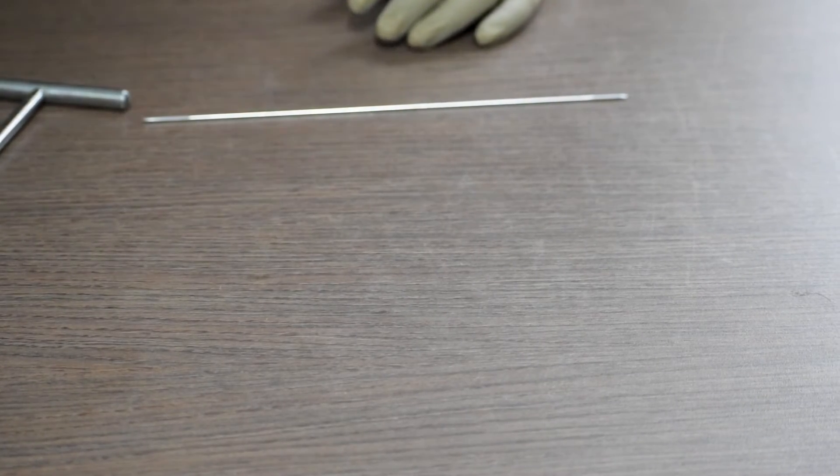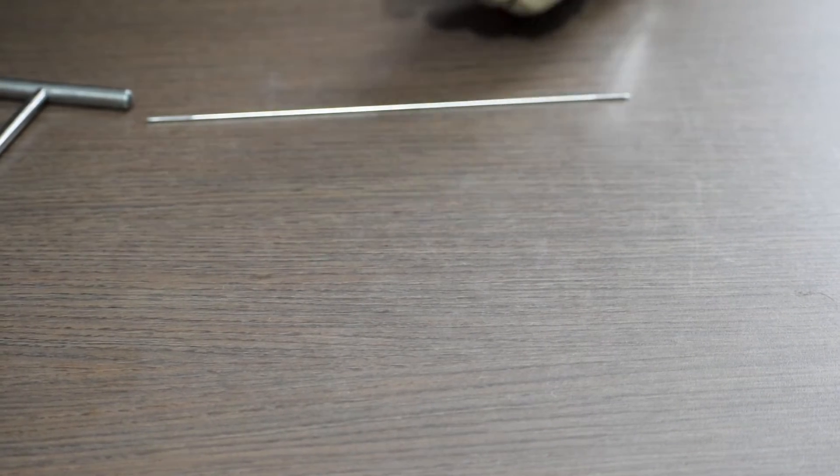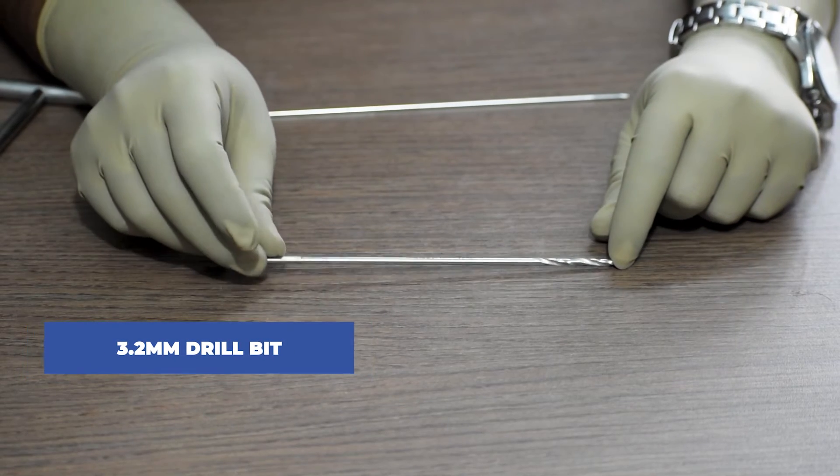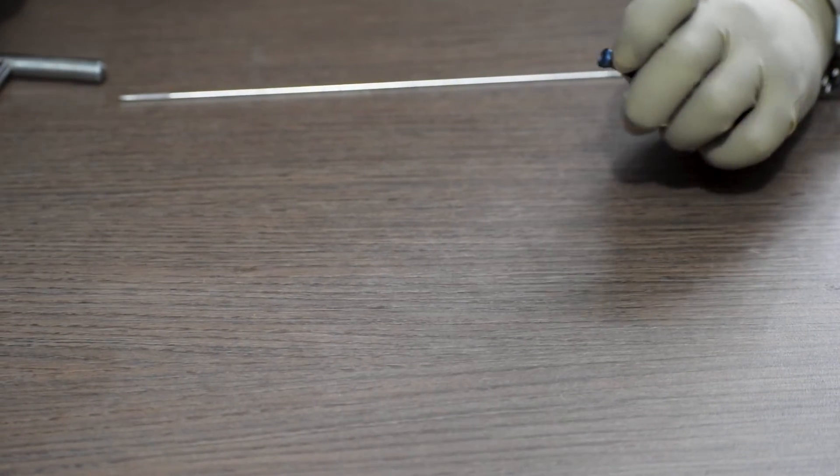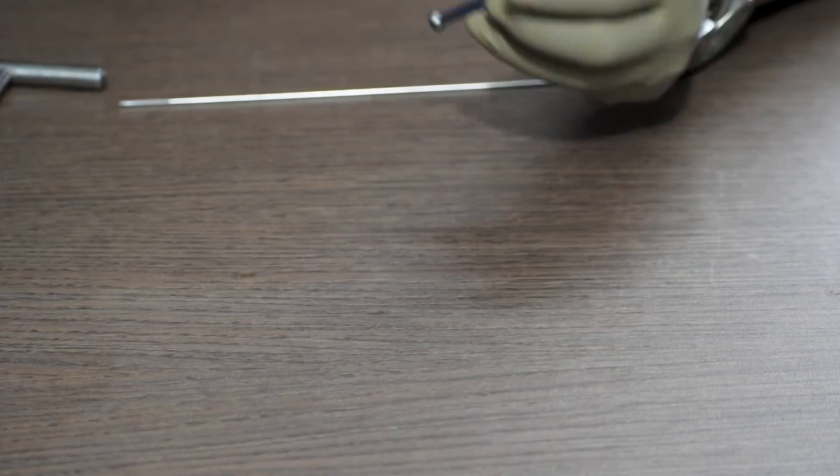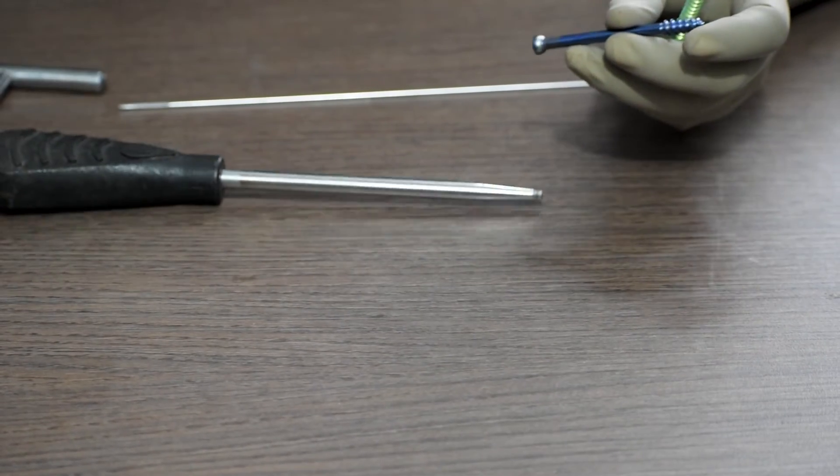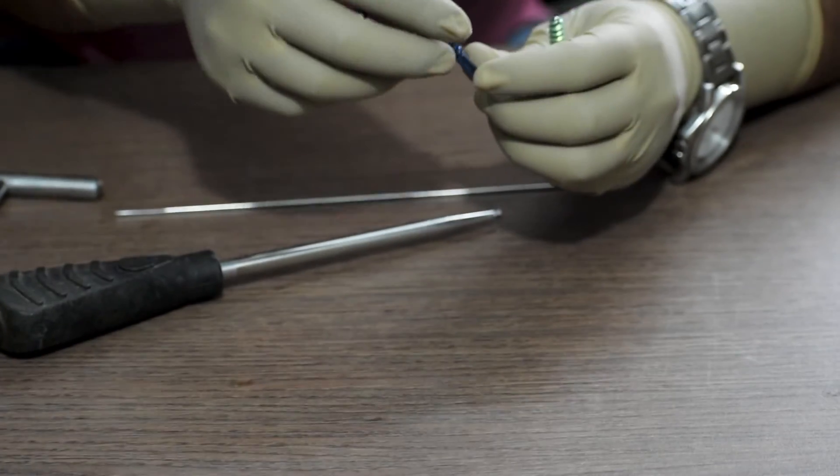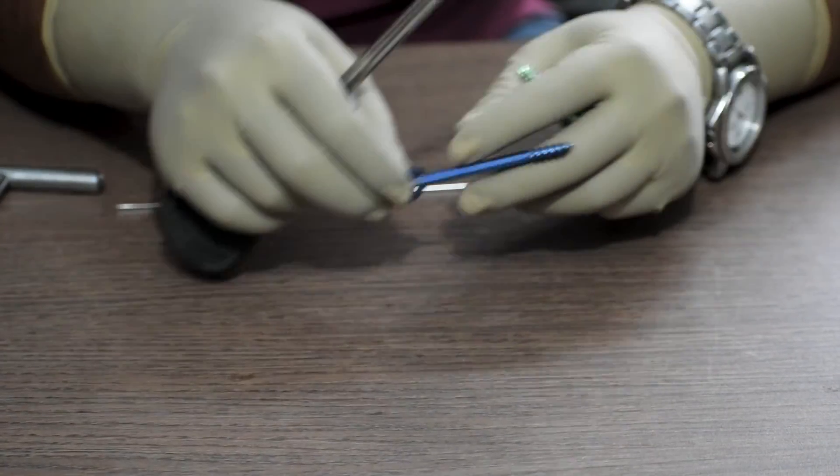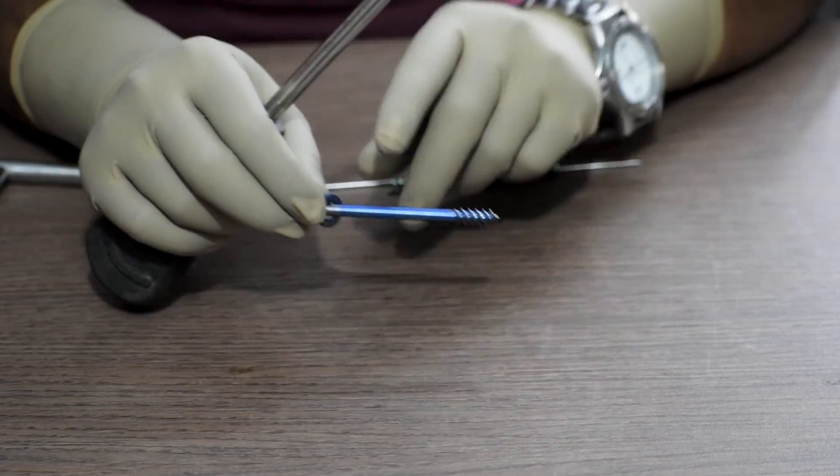Now, if we require to fix the solid screws as well, we will use the 3.2mm solid drill bit. Once the drilling is done, we will take the 6.5mm short thread or full thread cancellous screw, whichever is required to be fixed, of measured length. And we will also use a washer.